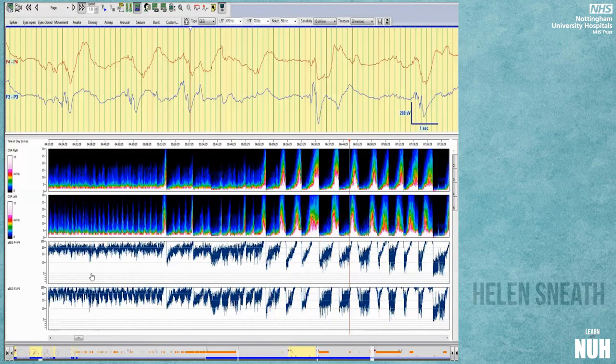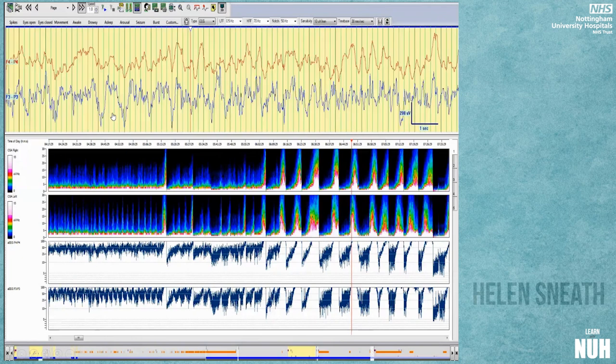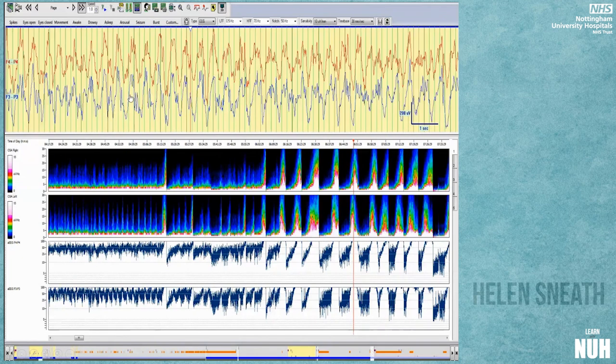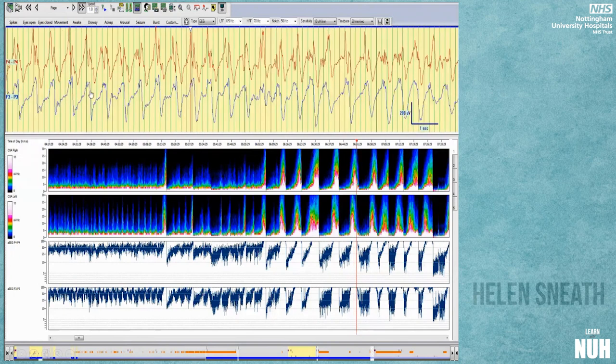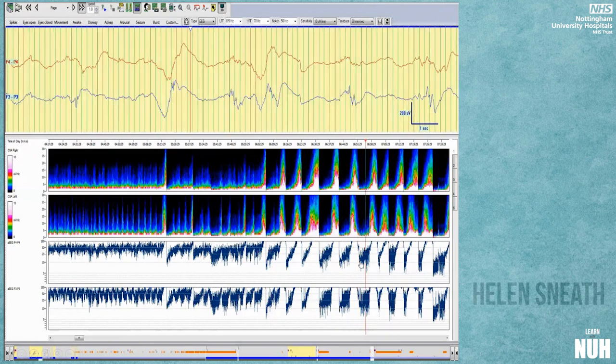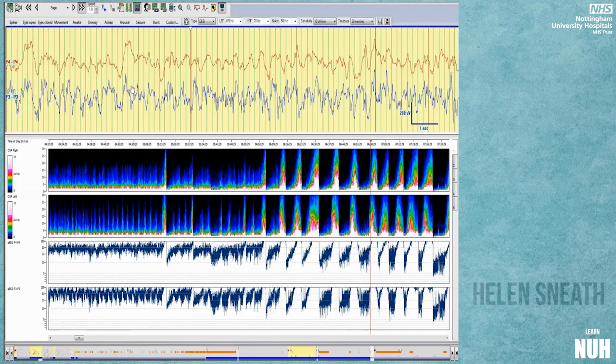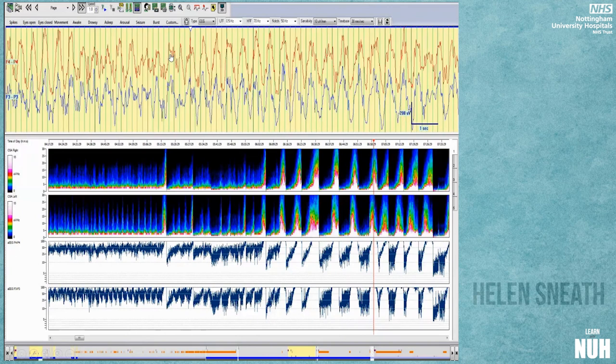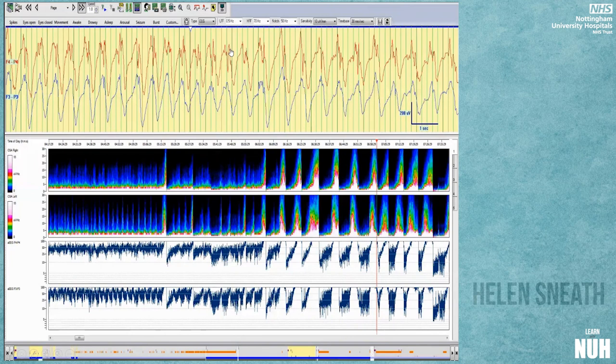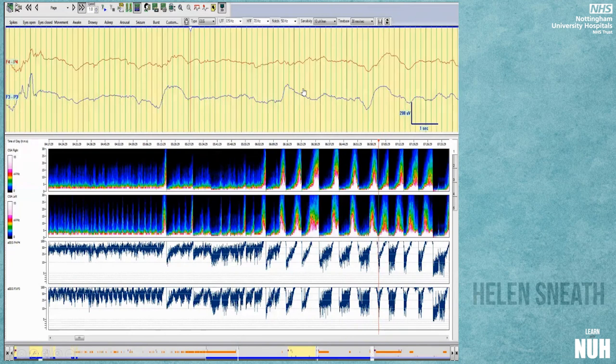It's always difficult just from a screenshot to give a flavour of what the CFAM actually does. We'll talk about the evolution of a seizure - when we say evolution, we mean the seizure will build up over time. You can see a change in this raw EEG. Can you see how it's evolving over time? The waveforms are changing. We're about to start another seizure - you can see a build up, faster activity, moving over to the right side as well, higher in amplitude as you reach the peak of the seizure, then it starts to die back down again and disappears.